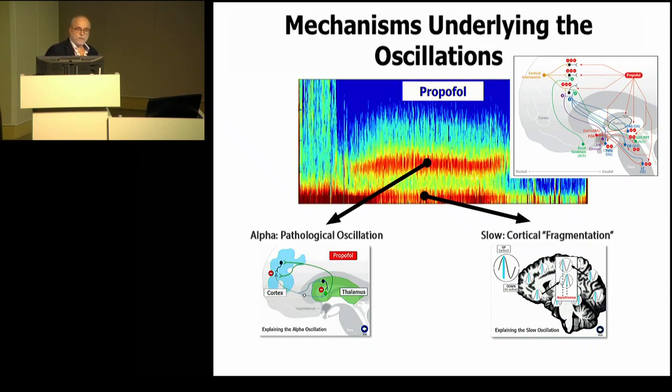The magic of this thing, the most interesting thing, is that we have been able to fit what we know in the neurophysiological studies together with the spectrum. And we've been able to say how the neurophysiological change due to the effects of the propofol can be registered. We are able to understand how this neuron activity is translating into the EEG.